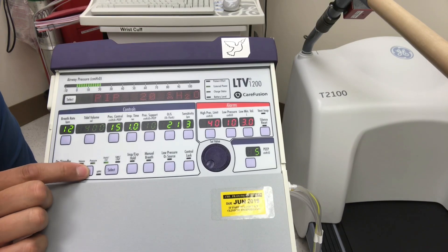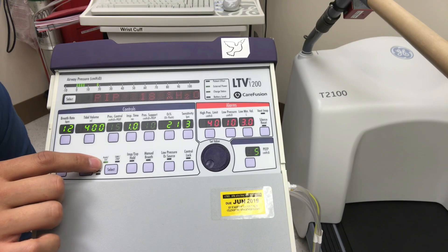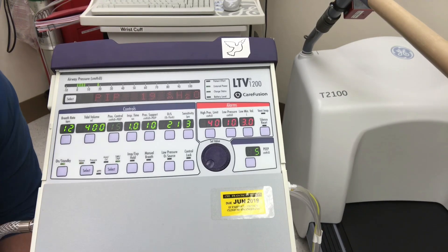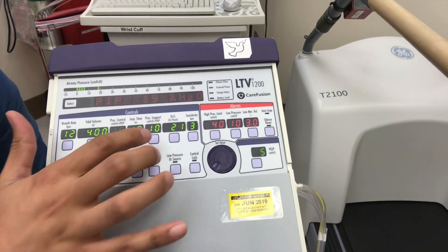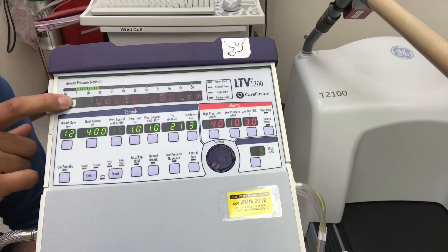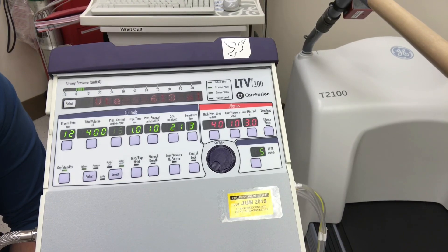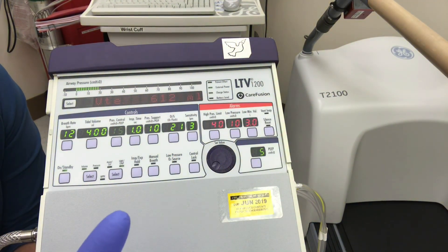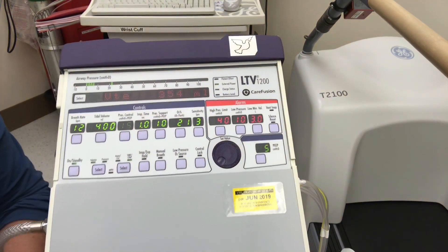Now let's go to SIMV, which is a volume control mode. Touch-turn: hold once, hold twice, it stays. Then switch the mode — hit once, twice, it stays. Now we have rate, tidal volume, and also pressure support that we can dial in for true SIMV. We're currently riding the vent. As we add breaths, you'll see they vary — 12 of them are mandatory at 400 mls, and the rest are spontaneous at the pressure support level, for example 10 over 5.